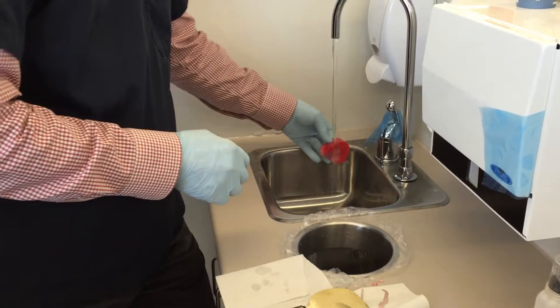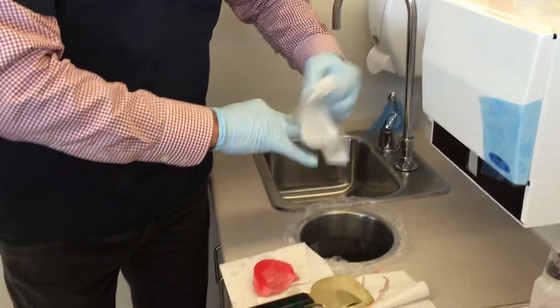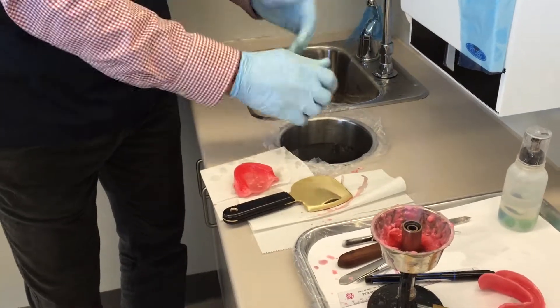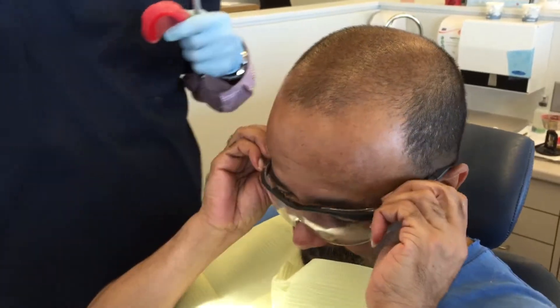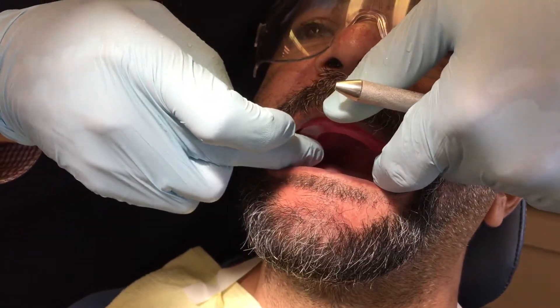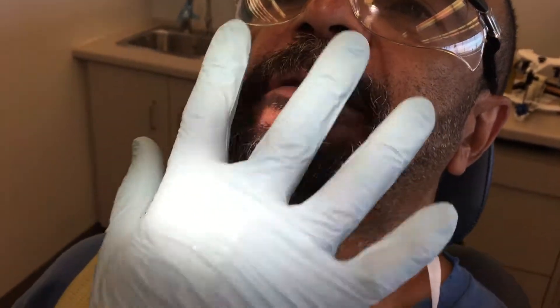There's a little bit of wax residue on my gloves — if you can't get it off, just get another pair. I hope you heard the little squishing sound on the video, because it's a very good sound. We still have a little bit of wax showing there — just get you to open slightly, good.